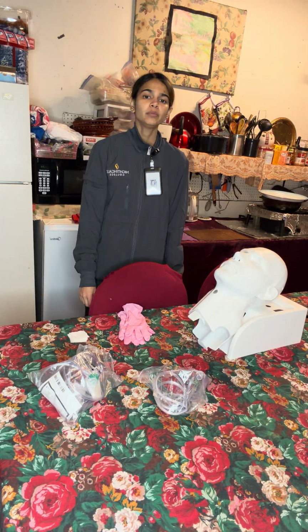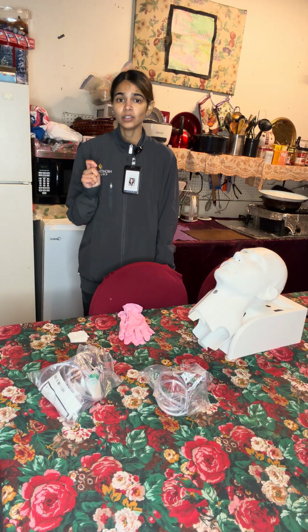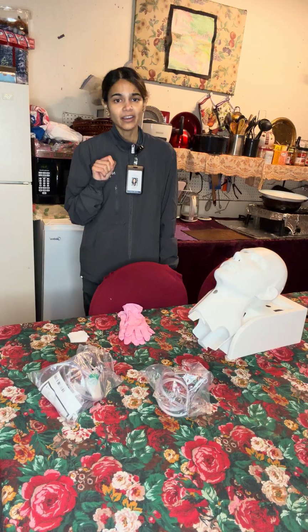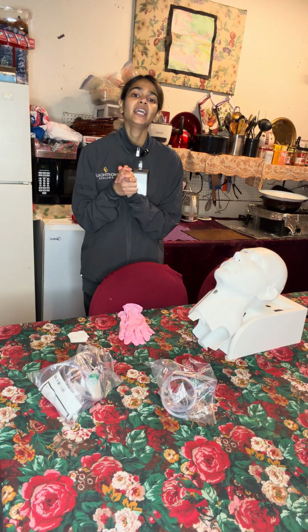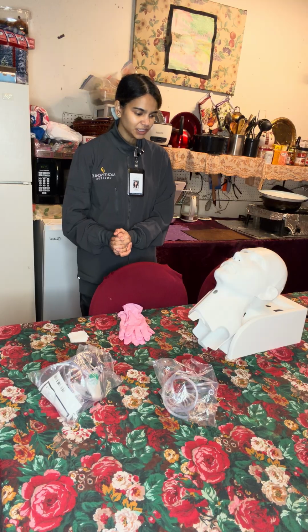The first thing that we'll be doing is entering the patient's room and ensuring patient privacy. This will mean closing the door or pulling the curtains. After, we'll perform hand hygiene and introduce ourselves to the patient. Hello, my name is Pranita and I will be your nurse today.